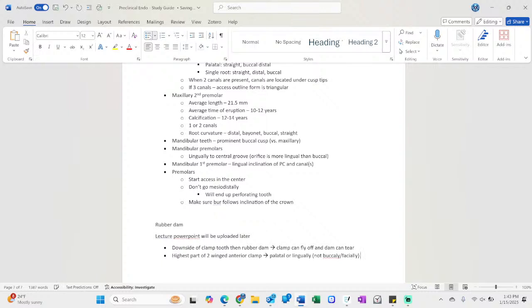So this here is called Oraseal. You can also use Cavit for this. So what this is doing is, even though you may have a nice tight seal, sometimes, especially on a lower tooth in the posterior, the saliva can bubble up underneath there, or vice versa with what you're spraying. So by placing the Oraseal around the tooth, that prevents any seepage of anything.